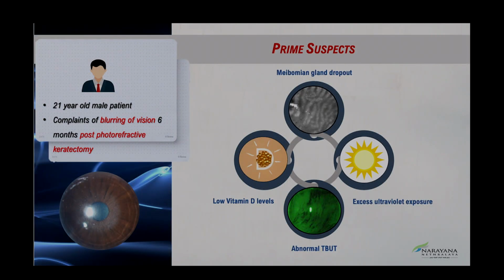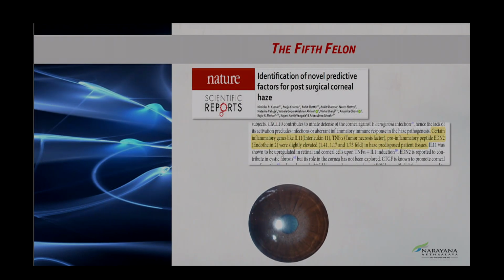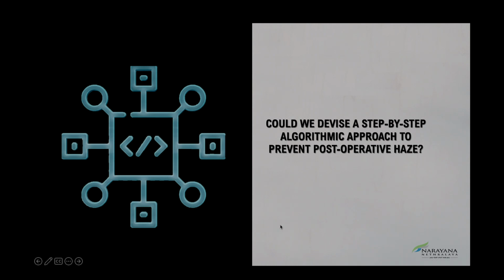The other reason why this is important is that an irregular epithelium is also a sign of ocular surface inflammation. And if you just go ahead and do a refractive PRK procedure, they may develop corneal haze post-surgery, because whenever you have pre-existing inflammation, even if you use mitomycin C or give proper lubrication and everything after surgery, these patients are at higher risk of developing post-PRK haze. So that is why epithelial mapping is extremely important.